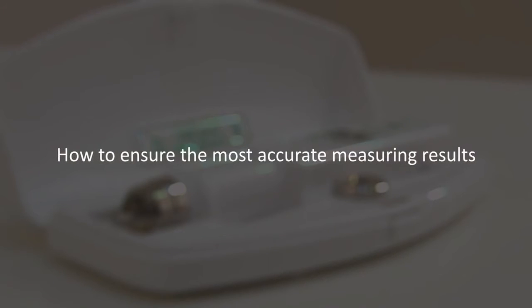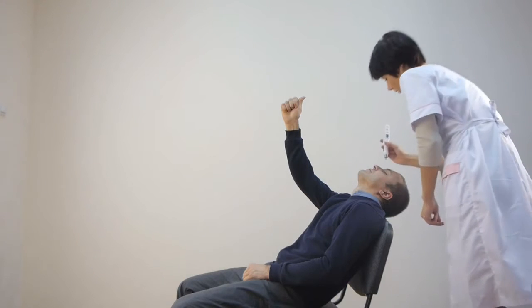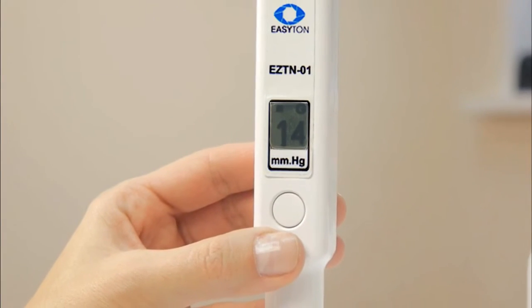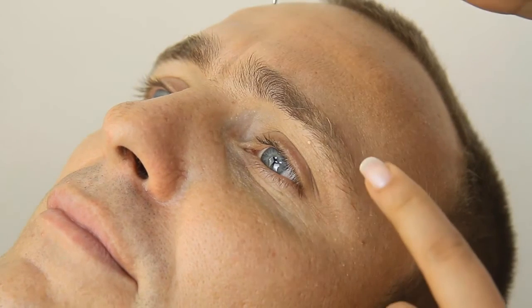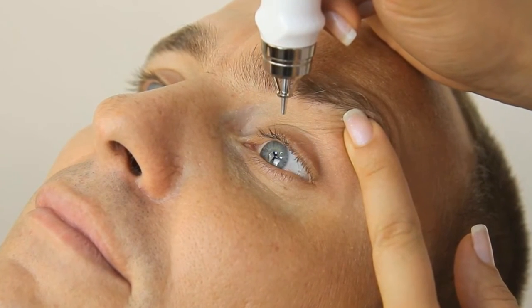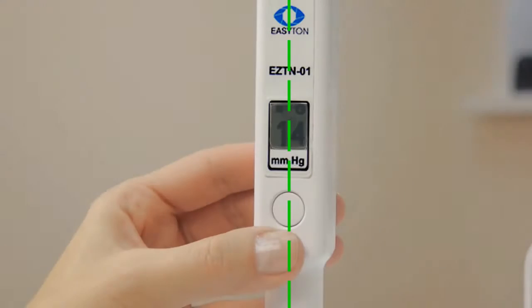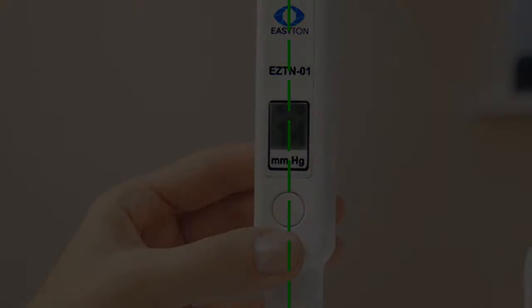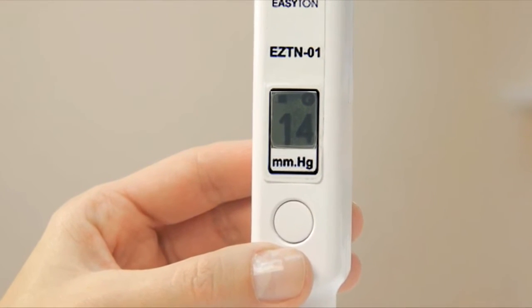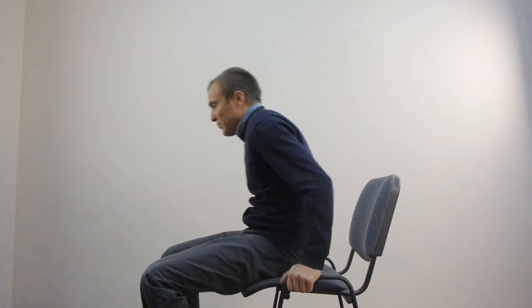How to ensure the most accurate measuring results. Follow these simple rules to achieve precise measurements. Ensure a proper grip and gliding movements of the tonometer. Provide support for the hand to make your own movements more precise. The patient's gaze must be fixed at the test object. Place the tonometer strictly upright. Stretch the eyelid smooth, avoiding any folds. Place the tonometer rod properly and make sure it doesn't shift along the eyelid surface. The proper patient's position is ensured.